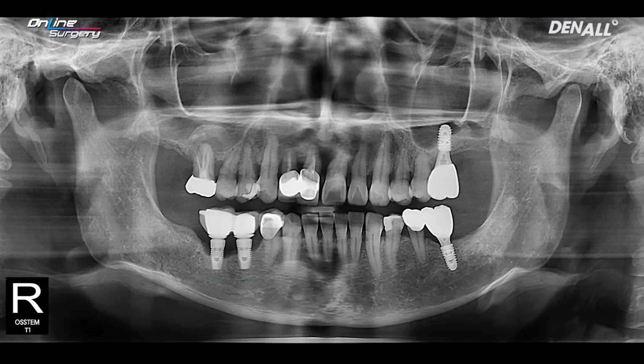What's problematic for this patient is that the abutment cuff height was very minimal at about 1 millimeter, so crestal bone loss was somewhat expected. And if you look at the extent of bone loss, cortical plates, both on buccal side and lingual side, have all evenly disappeared.